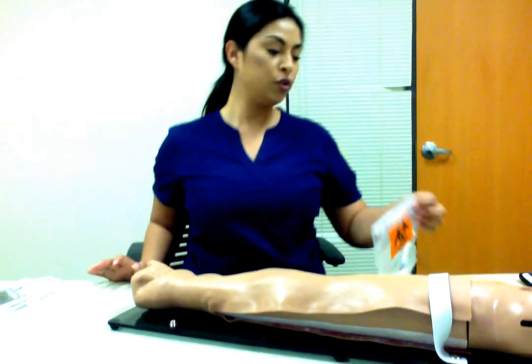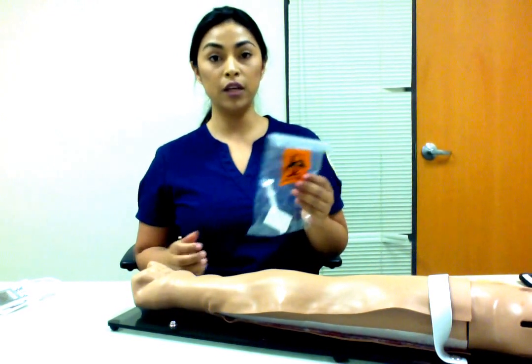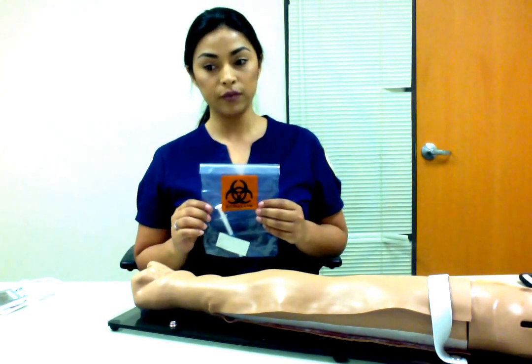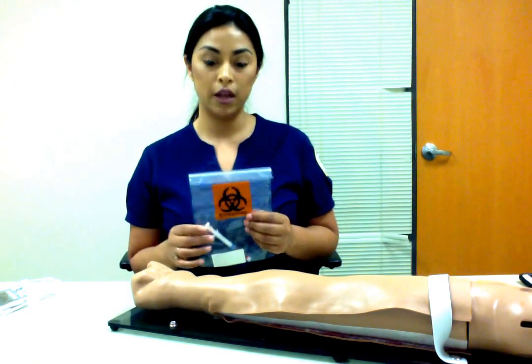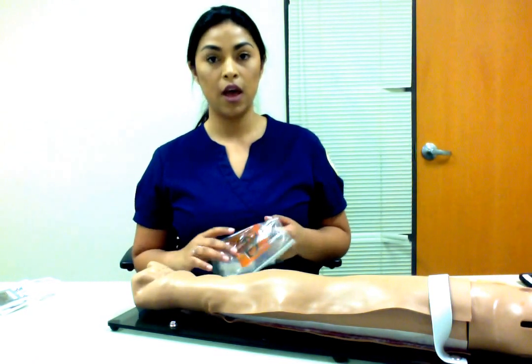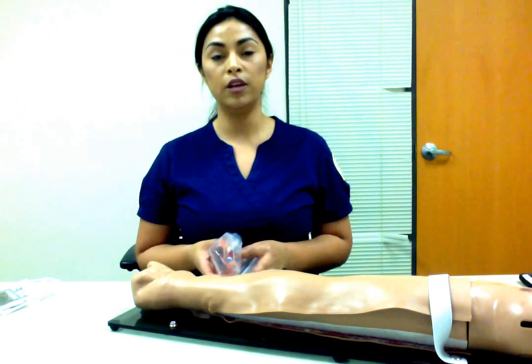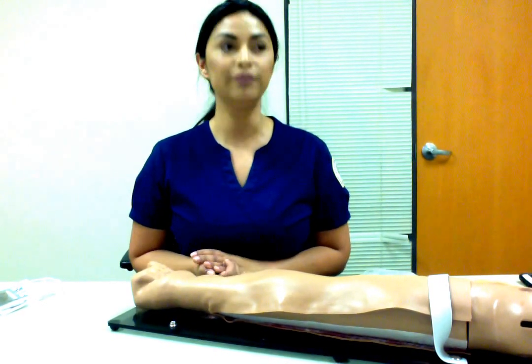Then you would want to perform your analysis of your ABG within 15 minutes. If you are not going to analyze it within 15 minutes, then it needs to go in the ice slush. And this is to prevent metabolization of the blood. And if you do not perform it within 15 minutes of being in the ice slush, then you cannot go past an hour. If it goes past an hour, you would need to resample your test.